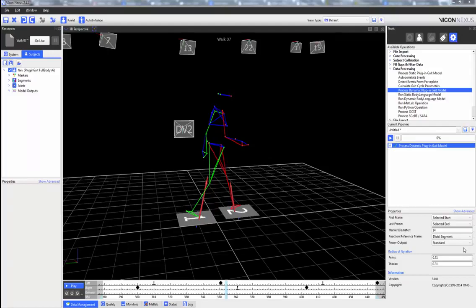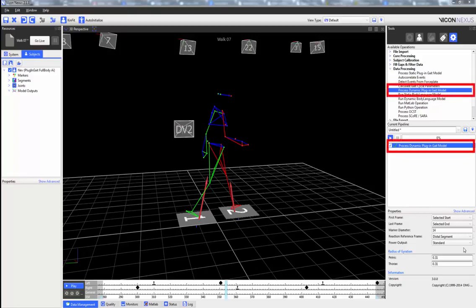After the dynamic trial has been captured, the trial has been labeled correctly, all gaps have been filled, and any other pipeline operations such as filtering have been run, the process dynamic plug-in gait model can be run.